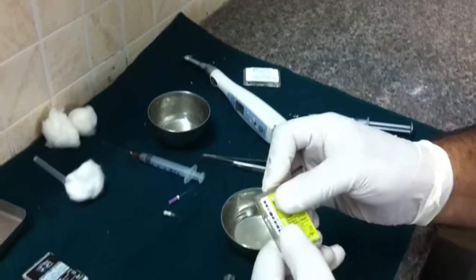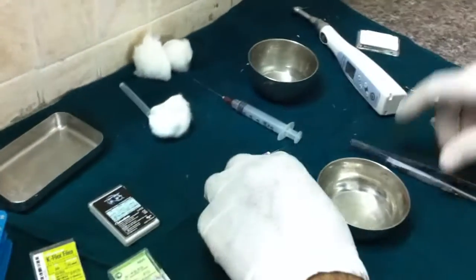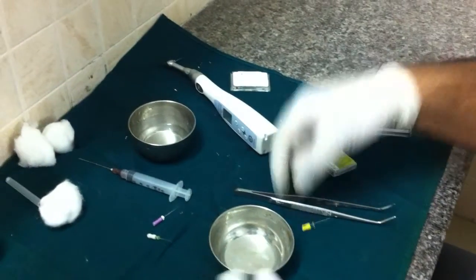Now continue the glide path using a 20 size K-Flex file, the same working length, 17.5.